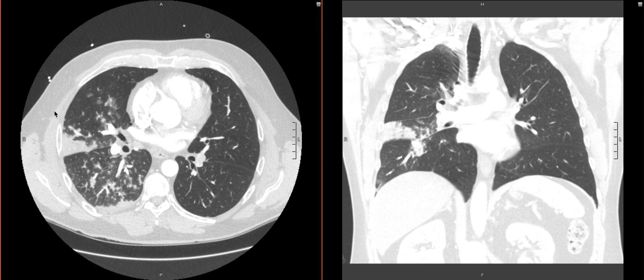In the setting of this patient who does have pulmonary emboli, this is very characteristic of a pulmonary infarct. When looking for the sequelae and consequences of pulmonary emboli — in addition to looking for elevated right heart pressures, which has an impact on clinical management — it is also very useful to interpret these findings appropriately, including wedge-shaped peripheral consolidations in your differential as potential pulmonary infarcts.